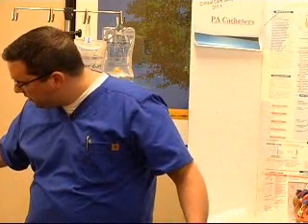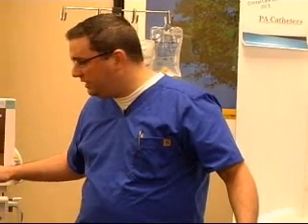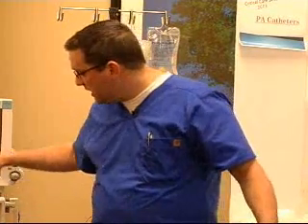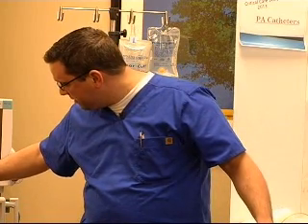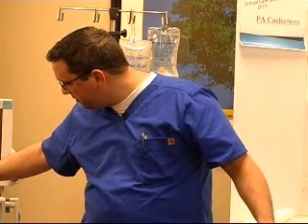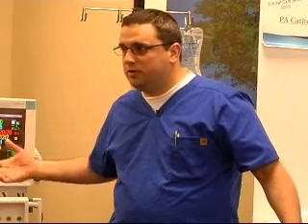There's a really easy way to remember this. Okay, if your patient's ventilated, it's in the valleys. So whenever you're looking at your waveform here, if you have your respiratory deflection from respirations regarding your ventilator, ventilators are in the valley. So you're looking for that first initial change, not the very bottom, but the first initial change right there. So this one, you can move your reference line up or down. This one, I'm going to move it down a little bit. So that gives you your correlation. That's your cursor and tells you that's what your wedge pressure is.